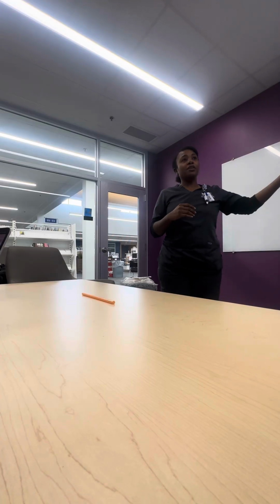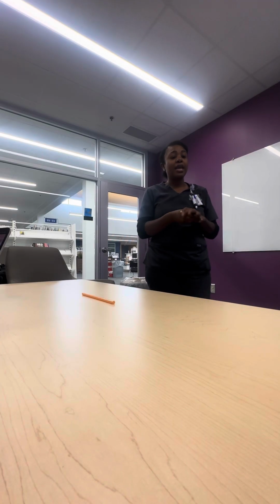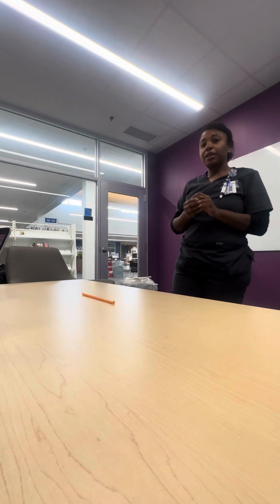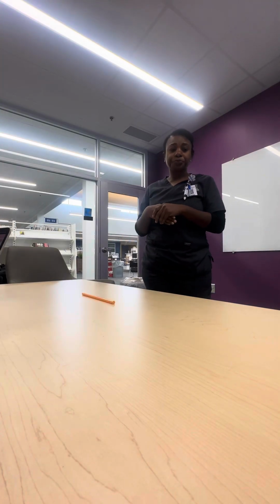I'm gonna introduce myself. My name is Keosha. Today I'm your student nurse. I'm gonna provide privacy, wash my hands. All right, can you please verify your name and date of birth? All right. Are you experiencing any pain today? With 0 being no pain, 10 being the worst pain you ever experienced in your life?